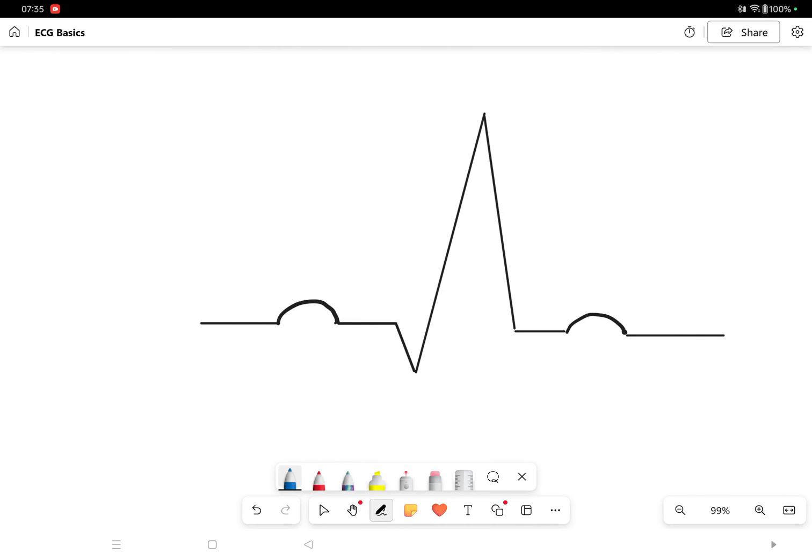Okay, so absolute basics of the ECG. Very, very important information that you'll appreciate needing to know. So first and foremost, we begin with the fact that the ECG is essentially a reflection of the electrical activity of the heart. This is all to do with the electrical conductance. Any defects in the wiring of the heart, whether that's due to a heart attack or a thromboembolic event, can also be seen here.